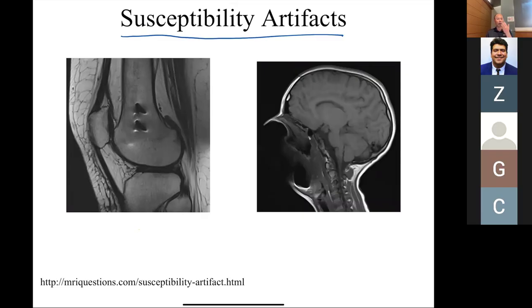Okay, that's one thing. But we all get MRIs done all the time, right? Braces, yeah. So this person has metal braces or something in their mouth that's perturbing the fields enough. There is obviously air, but when you close your mouth, it's not so bad, right? But yeah, this person is fine. It's just that they should never have been scanned in an MRI, okay?